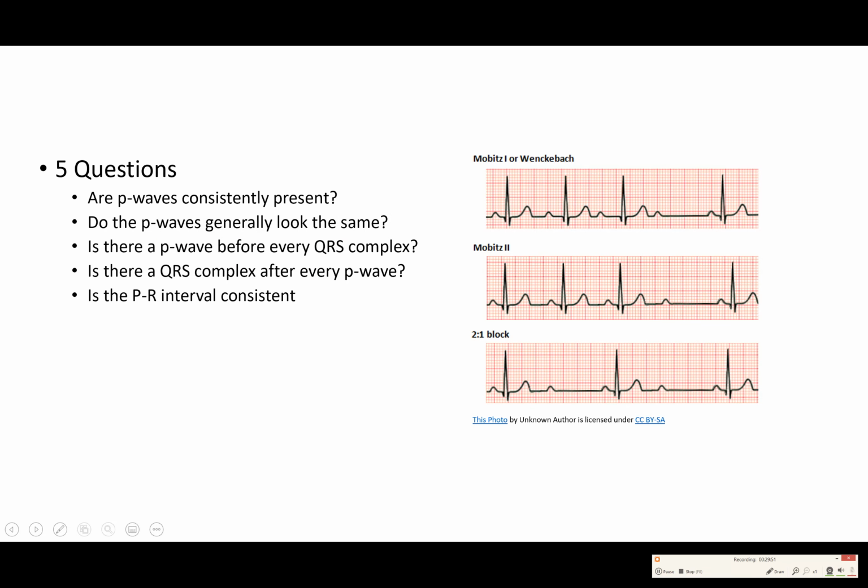Okay, so we've actually looked at several common dysrhythmias in this, and we've looked at what is the approach to rhythm, right? So remember, in the big scheme, we're looking at the systematic approach, right? So step 1 was to determine the rate. That was a previous lecture. Step 2 is to determine the rhythm.